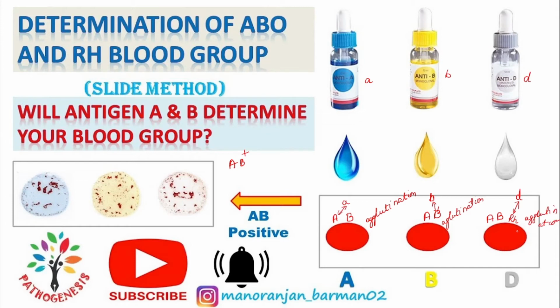So what is the role of this Rh antigen? If Rh antigen is present in one person, then he will be positive. If this Rh antigen is absent, then that person will be negative. So here we can see the result. So agglutination will be the result in all the cases with respect to each antisera.